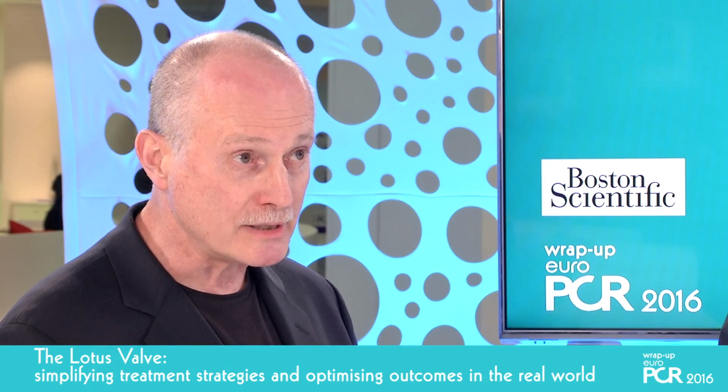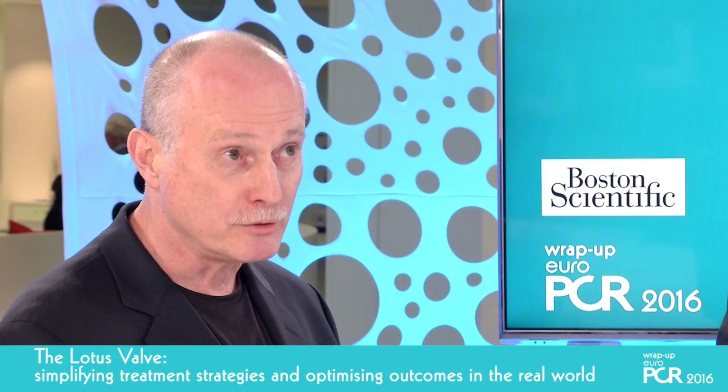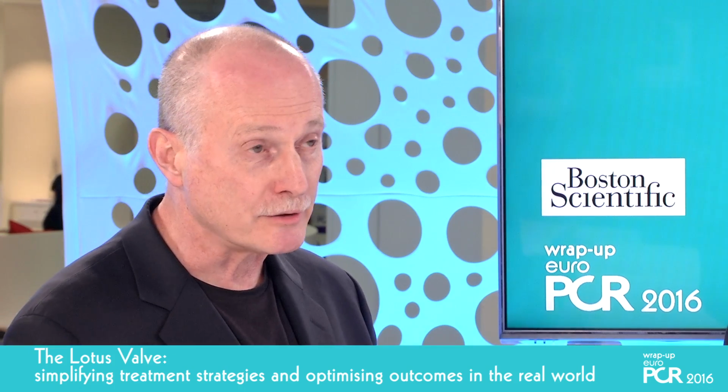And what we see from feasibility is what we expect from a TAVR device, a high degree of procedure success. And with the Lotus, virtually 100% implant success, because embolization is not possible when you can retrieve the valve. We see durable valve areas now in this early group out to 2 years, and hemodynamics that we would find typical for all of the TAVR devices, mean gradients in the 10 to 12 millimeter range.